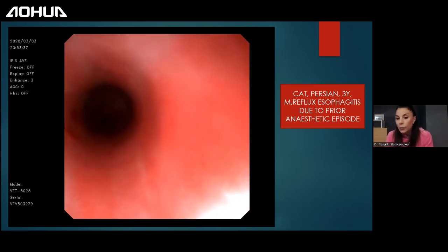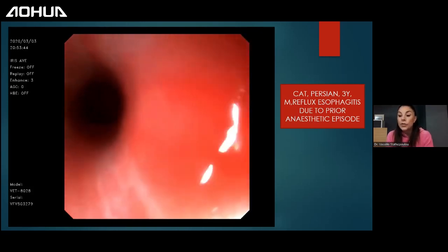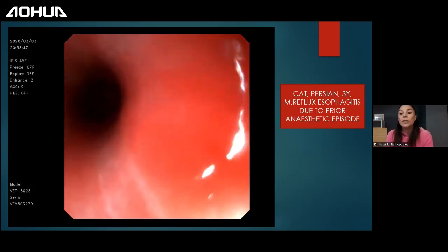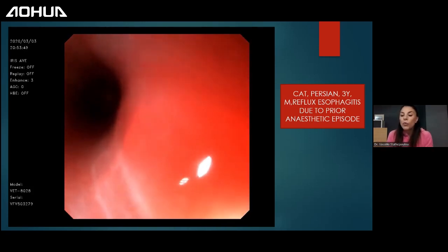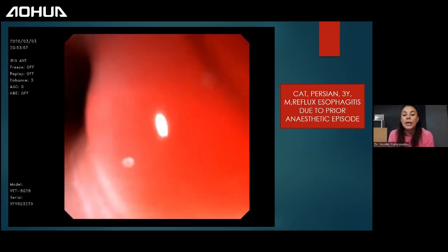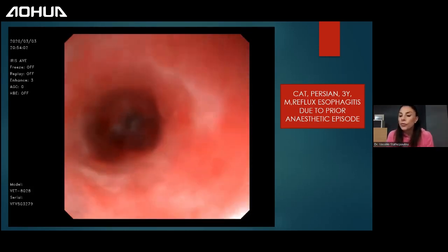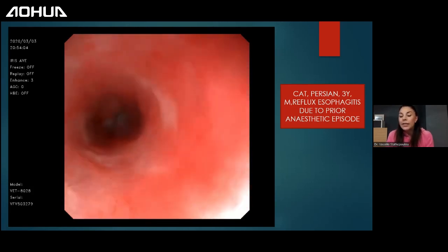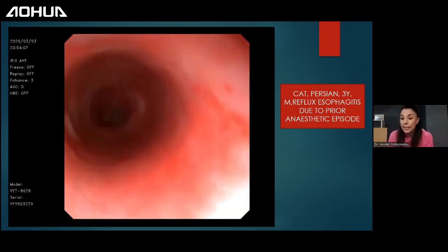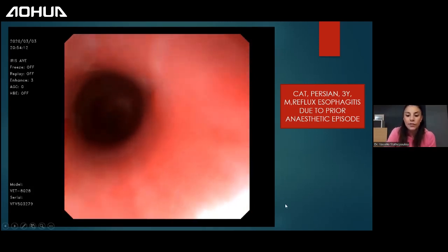Of course, there will be more reflux at this point, but it's more crucial to determine what's going on, if a stricture is already being formed, as I saw it in the beginning, so that we can go more aggressively and treat and manage it, so that we will not proceed into balloon dilations later. You will see that the esophagitis can be healed in 2 or 3 days' time. The esophagus has an amazing ability to heal these ulcers that you're seeing there.